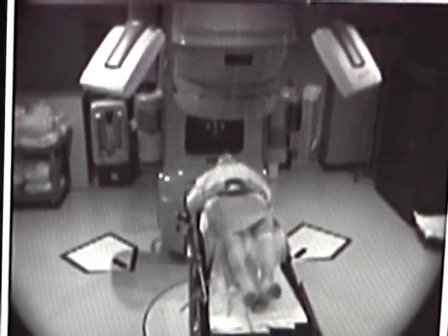Oh, great. All right, we're about to do a KV X-ray OBI matching on this head and neck patient who's already been set up to the marks on the mask, so we will begin the process. All right, Dr. Team? Extend the arms out.